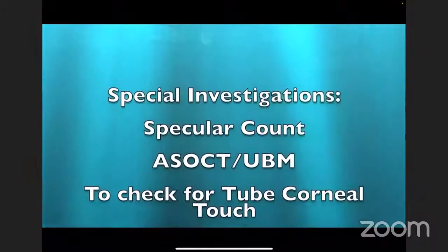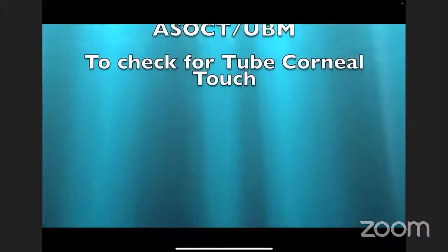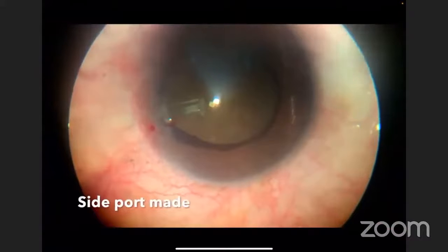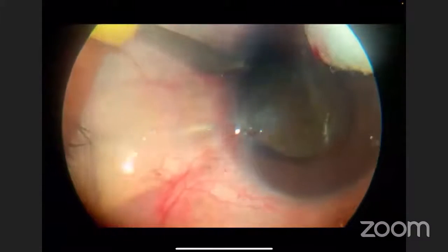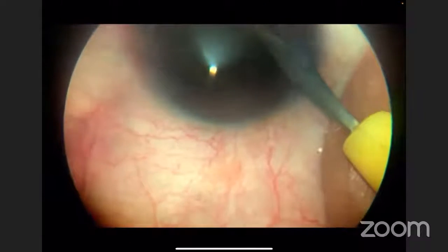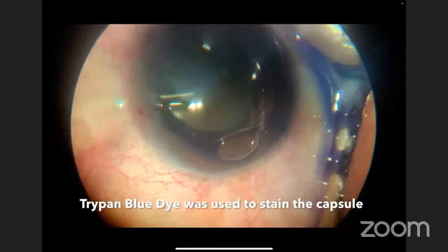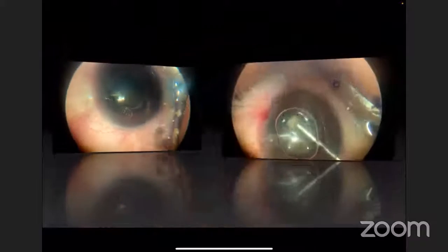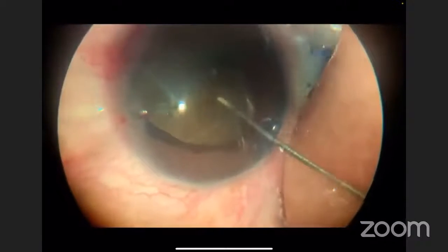So we did a specular count, which is very, very important. We also did ASOCT to check for any tube corneal touch in this particular patient. Now it is important to make a block, you can give whatever you want. The side port should be away from the bleb area and from the tube area. So staining is important because it improves the visualization. And then whenever you are manipulating, avoid any touch of the tube while insertion.